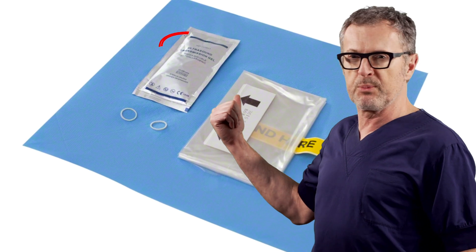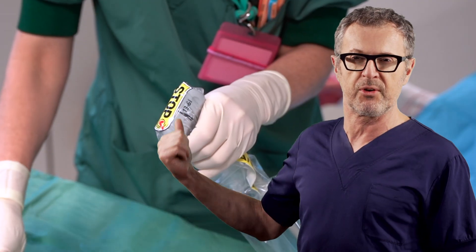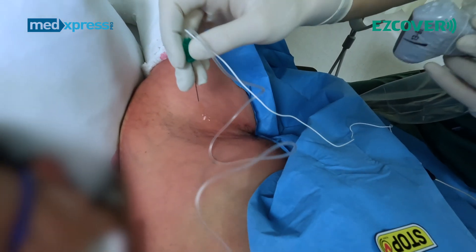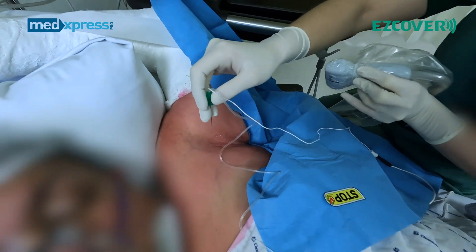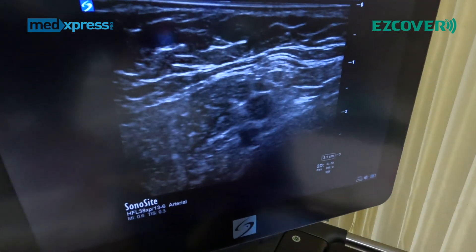This is why so many ultrasound probe covers come with a small package of sterile gel. In this video, I will demonstrate three common nerve block procedures and how we use Easy Cover — the ultrasound probe covers — with a second skin-like material where adherence from the probe to the skin is such that you do not have to use gel on a patient's skin for most applications.